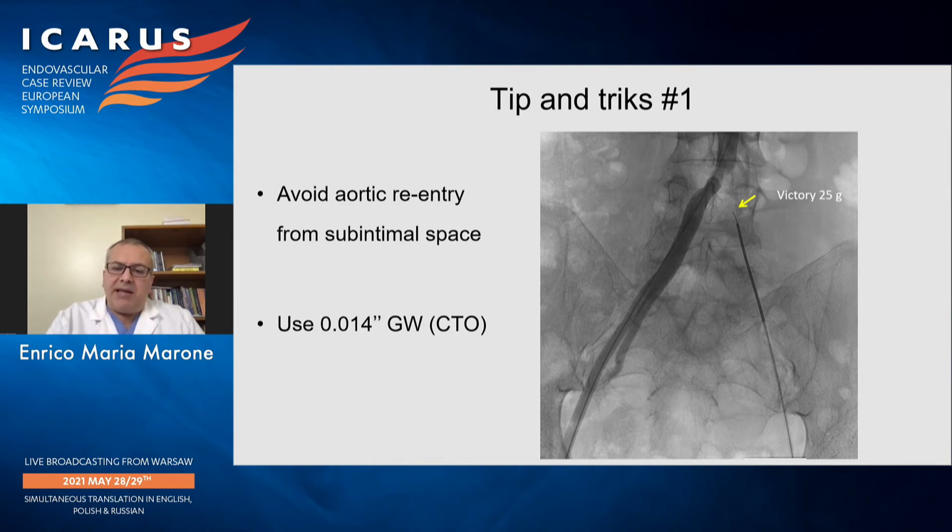In my experience, I prefer to avoid re-entry in the aorta. So I prefer to stay intraluminal, using 014 guide wires for chronic total occlusion.